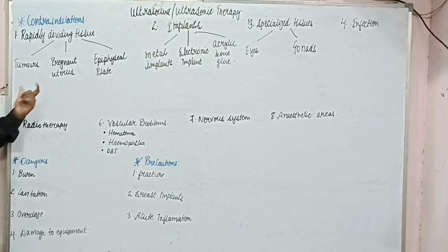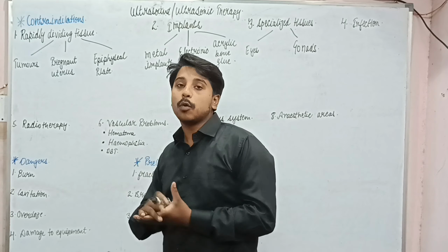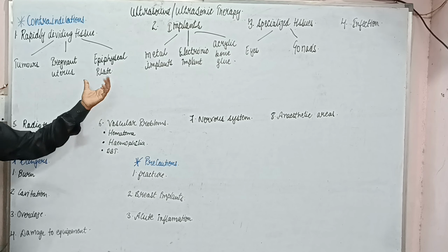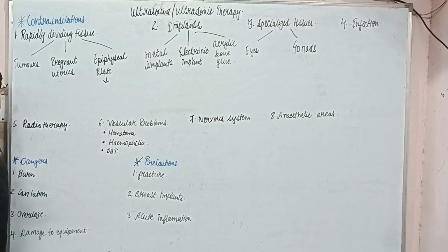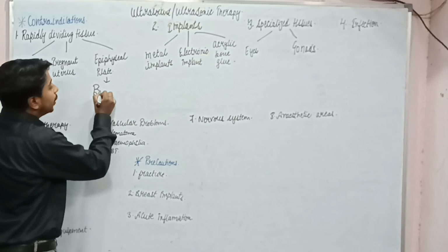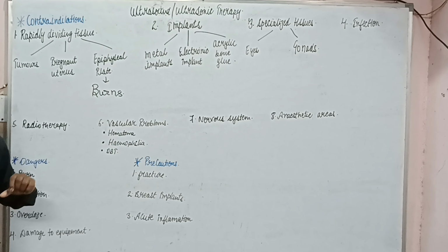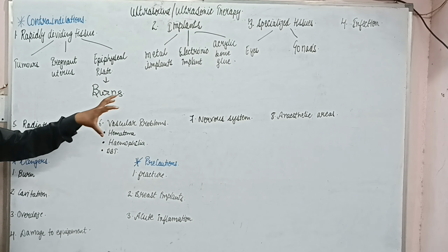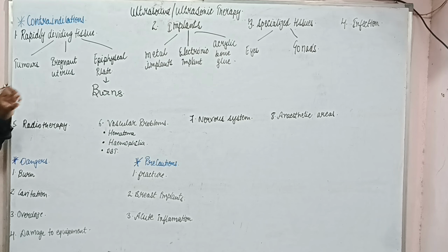Similarly, the same explanation applies to the pregnant uterus. Whenever the fetus is developing inside the uterus, the cell division is rapid and various anomalies can be seen. In the epiphyseal plate region, cell damage can also occur. According to some research, burns are also produced. It is cell damage that is produced, not cell division, in the epiphyseal plate region. So we avoid applying ultrasound on that region.